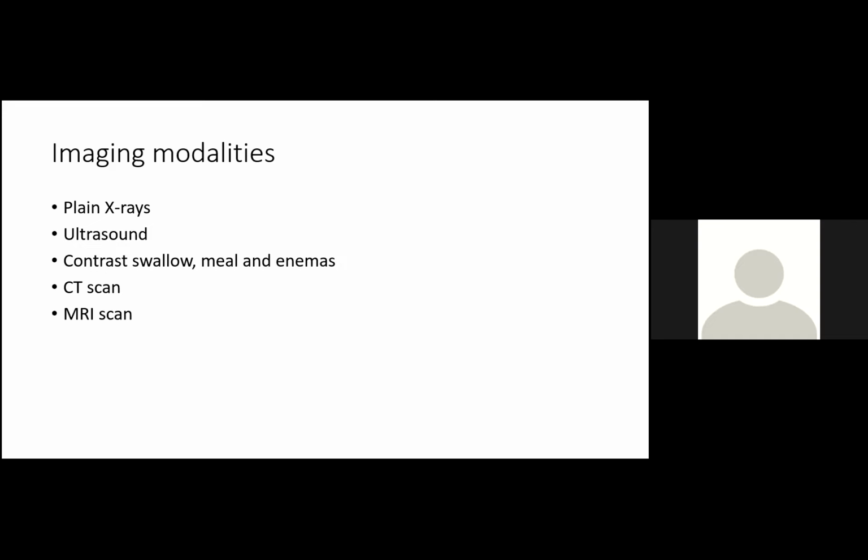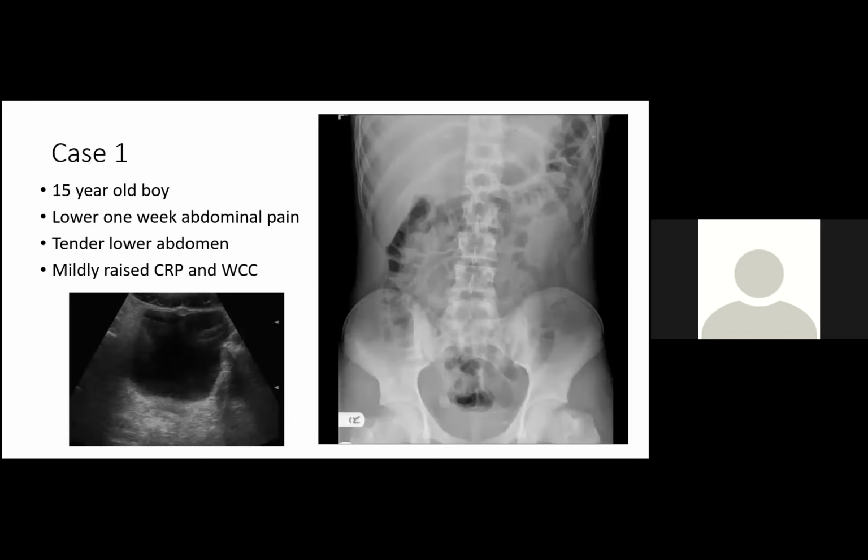So what I've done this afternoon is I've put together a range of cases demonstrating the kind of scenarios where abdominal X-rays would be useful, and also similarly the kind of scenarios where abdominal X-rays were not very useful, and also led to some delays in achieving the final diagnosis. So we'll move on to the cases.